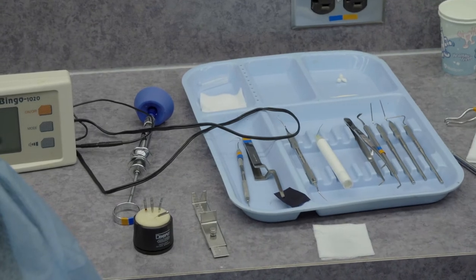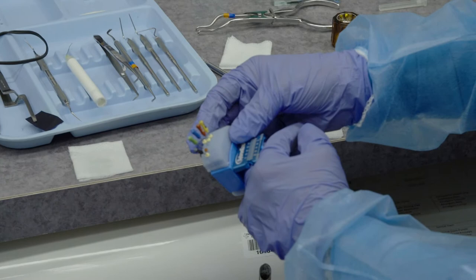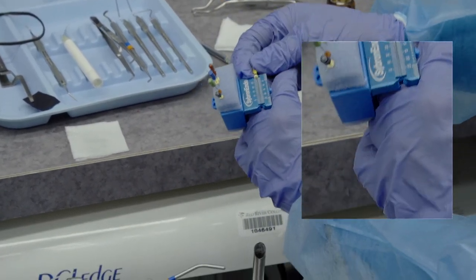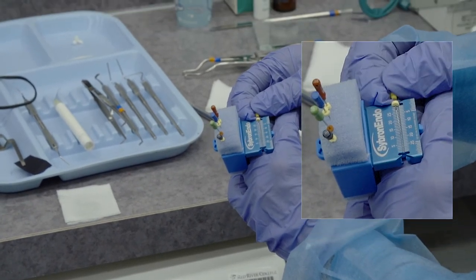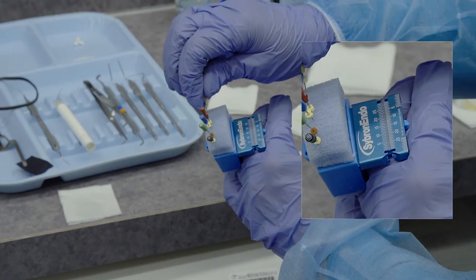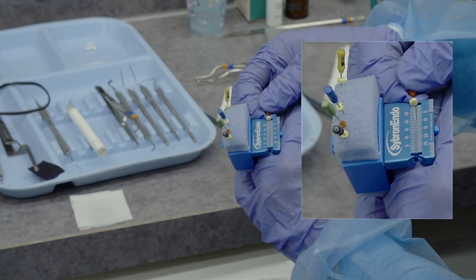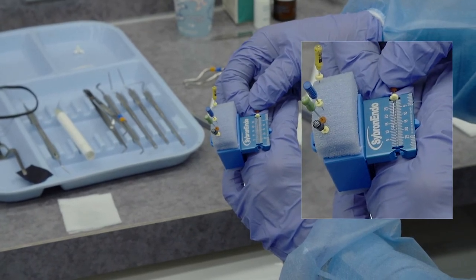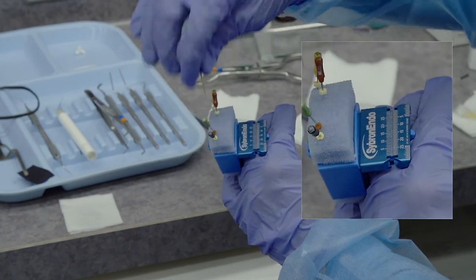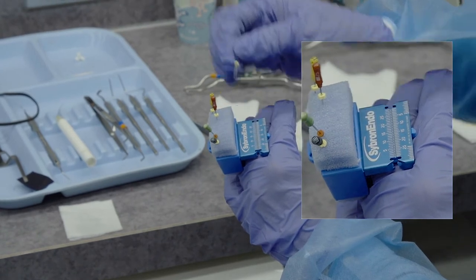Now the assistant will measure the files according to the working length, starting with the number 20 file, measured at 20 because the working length was 21. The next file is the 25 file. And the measurement is going to be 19, 1 millimeter off the last file. The next file is the 30, and it's going to be measured at 18.